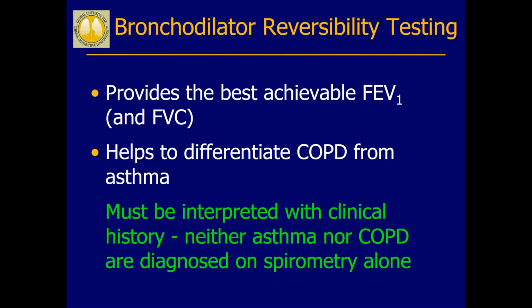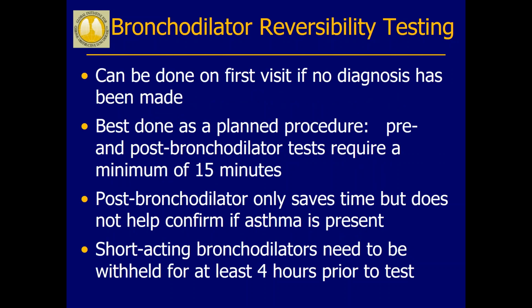However, everything must be interpreted with clinical history. You cannot diagnose asthma simply on spirometry alone. It's definitely necessary for the diagnosis, but there needs to be background history. In the case of COPD, in a prior session we talked about this, you need to have a history of smoking and some type of exposure to a noxious element, and it has to have time of that exposure. And asthma also has different background comorbidities and symptoms to help you distinguish if it's asthma.